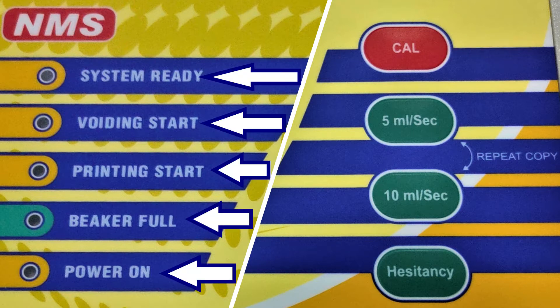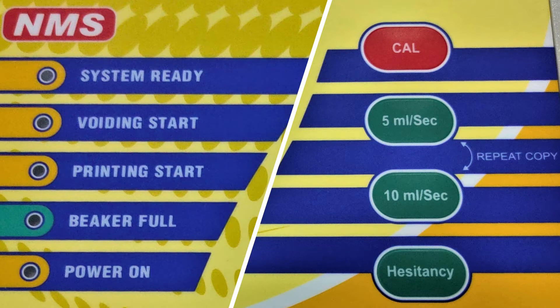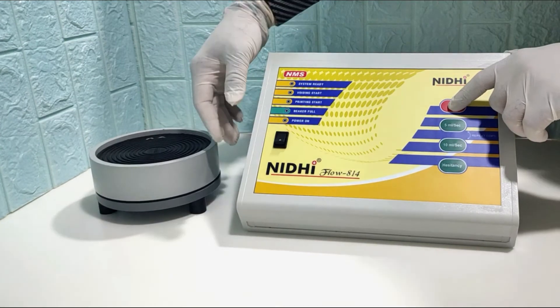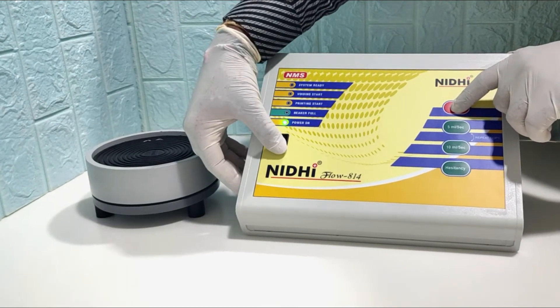Let's start the calibration process. First, long press the calibration switch and switch on the module.